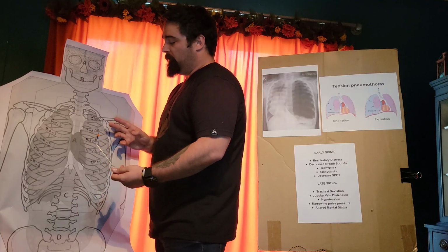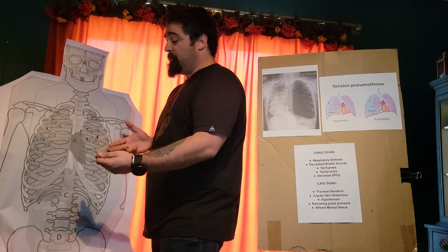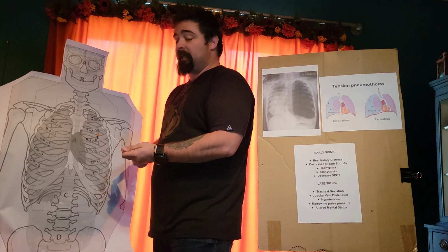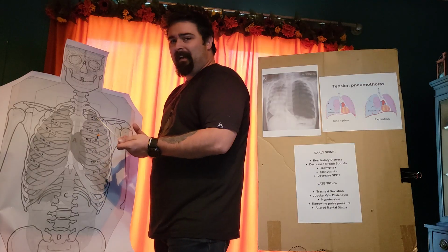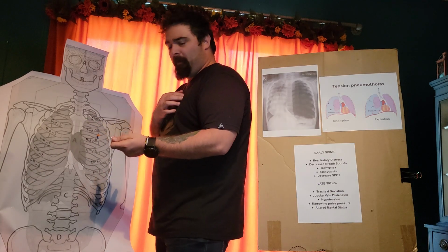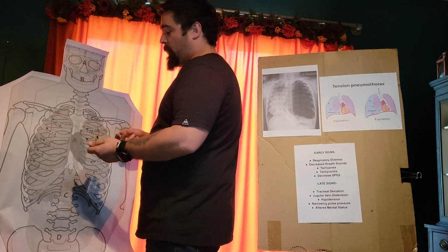There's no typical reason that you may have to secure this. Some people do, some people don't. It's not a permanent fix. It's not like a chest tube. It's not like an ET tube where it needs to be secured to continue to work. The muscle and anatomy shifting back and forth can kink the tube where it's not effective anymore, and also any muscle or adipose or blood can get caught up in the catheter itself and not allow it to work anymore.